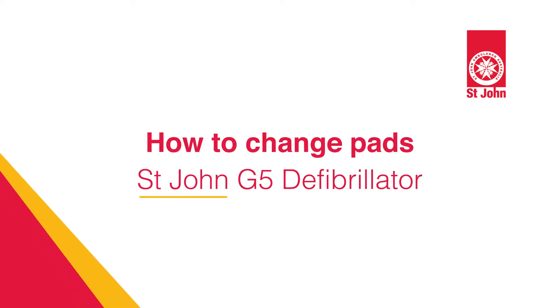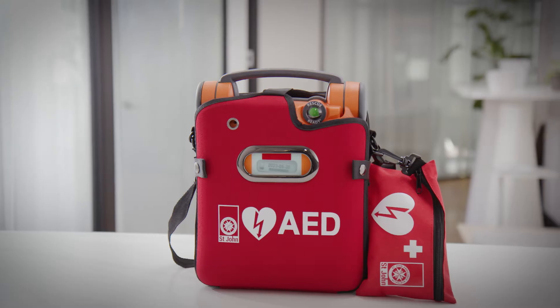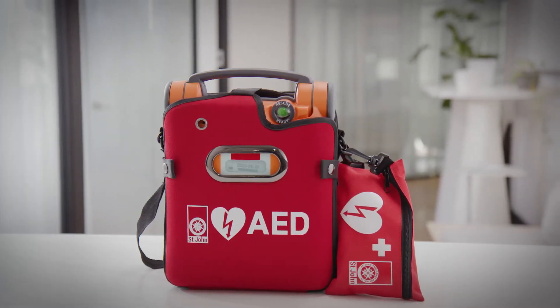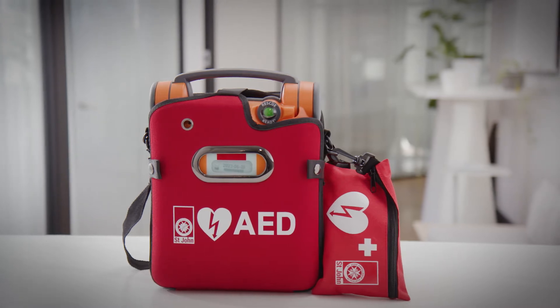In this video we'll walk you through how to change your pads on your St John G5 defibrillator. It's important to know when defibrillator pads need to be changed. Like most medical equipment, pads are designed to only be used once. They also have a shelf life of around 2 years.